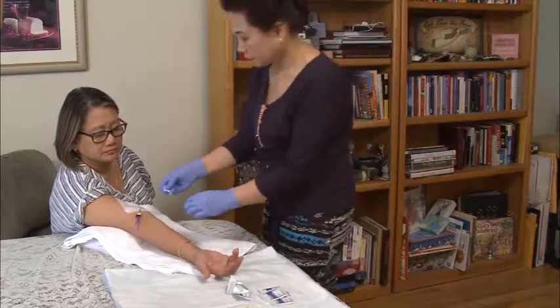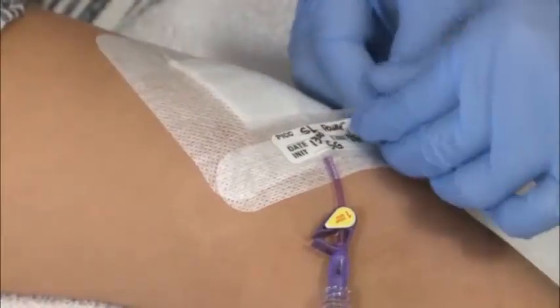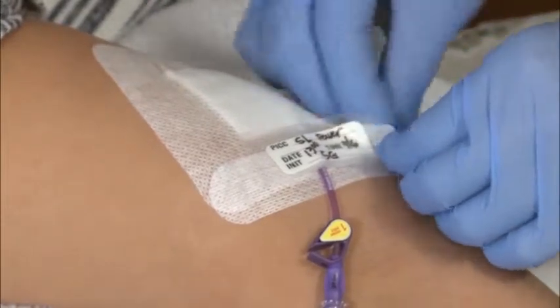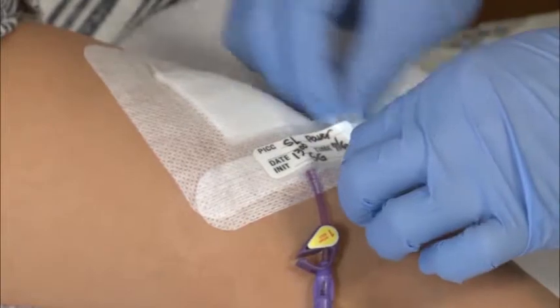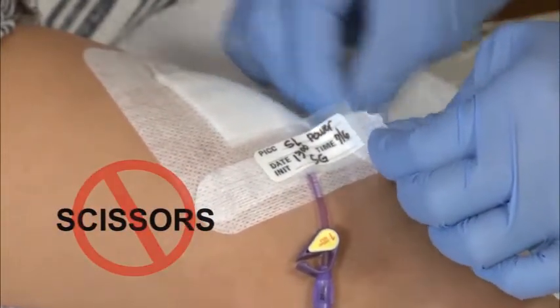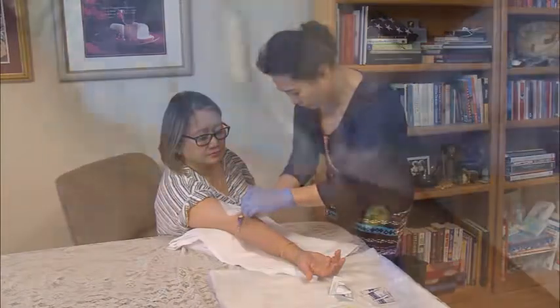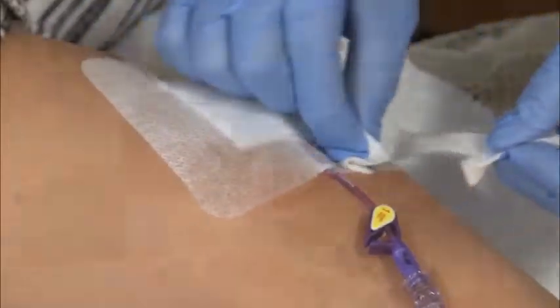Carefully remove the old dressing. If the tape sticks, you may wet the tape with either an alcohol or adhesive remover wipe to loosen it. Start at the bottom of the dressing, removing the label and tape. Never use scissors to remove the tape or dressing from your catheter. The risk for cutting the catheter is high. If cut, the catheter will have to be removed and other complications can occur.